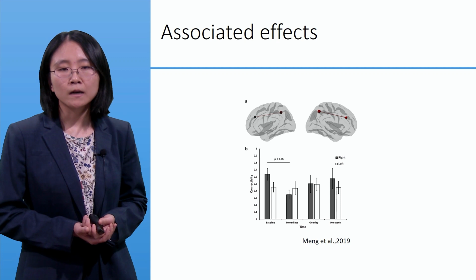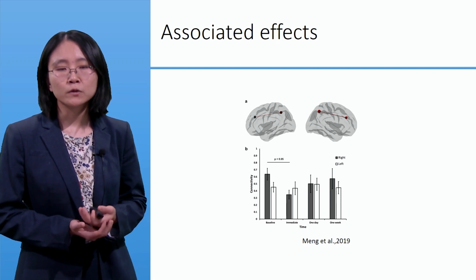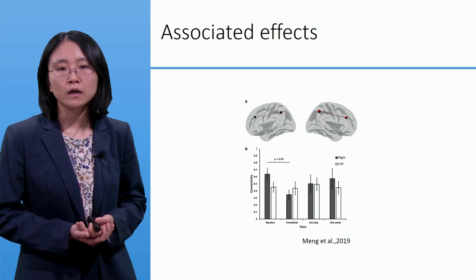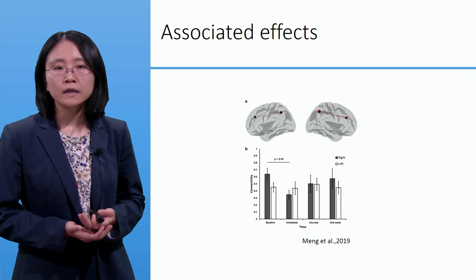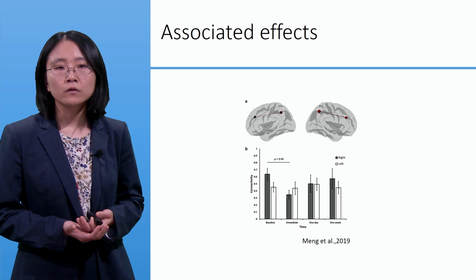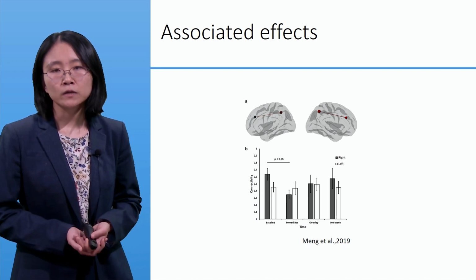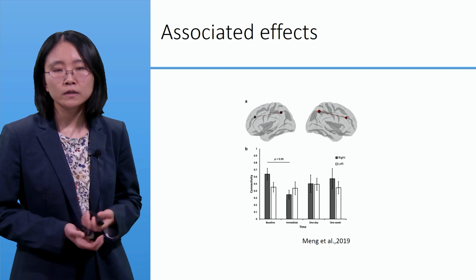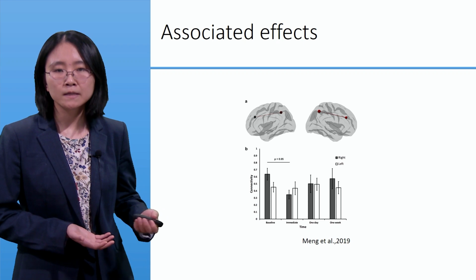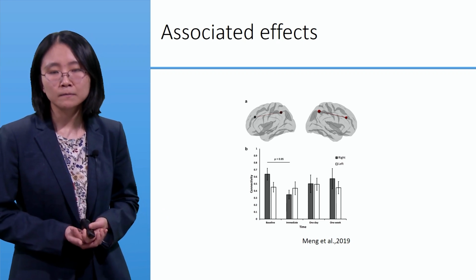In this study, using fMRI, we looked at how functional connectivity between the frontal and parietal networks changes after blood-brain barrier opening in the frontal lobe. Here we opened the blood-brain barrier in the right frontal lobe. So if we look at the right frontoparietal network, there was a significant decrease in functional connectivity between these two nodes that did recover in longer-term studies. This pattern was not observed in the contralateral side.